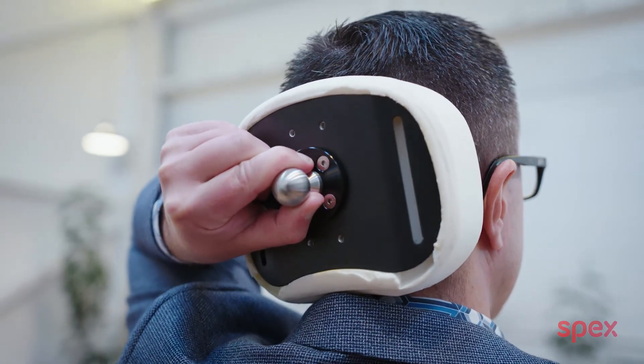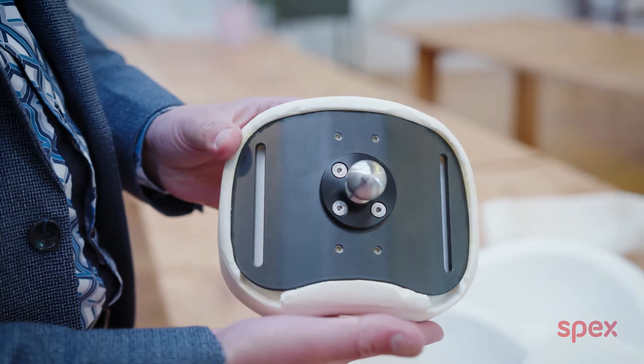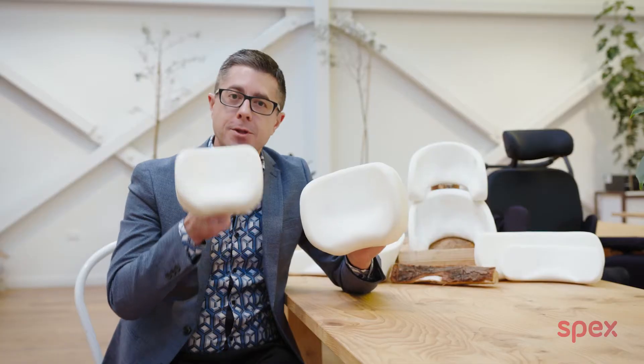The circle head support pad is one of my favourite head support pads, especially for people that want something discreet and minimal. The circle head support pad comes in two sizes: the circle 150 and the circle 250.